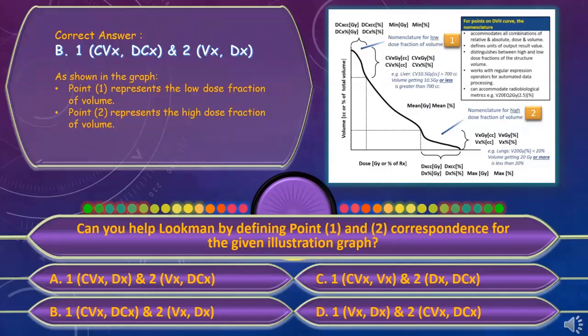Bilal, I have a comment on this point. Yes, sure. So, I don't have a problem if each physician has their own template, because sometimes they want to include certain organs. And if we had a single template that has many, many of these organs, it would just confuse them. So even if they wanted to have their own template, personally, I don't have a problem. But they have to be consistent in the naming. This is the problem we face.